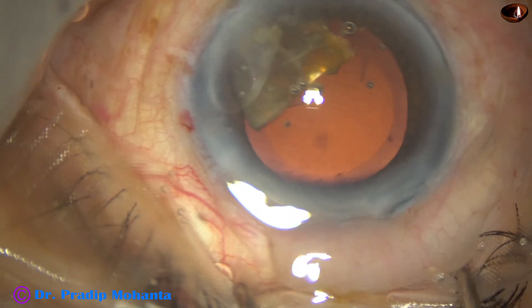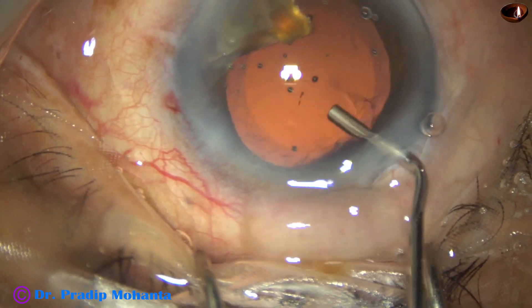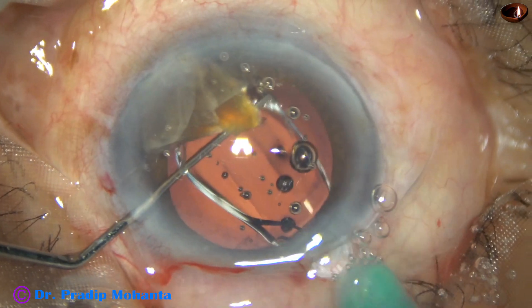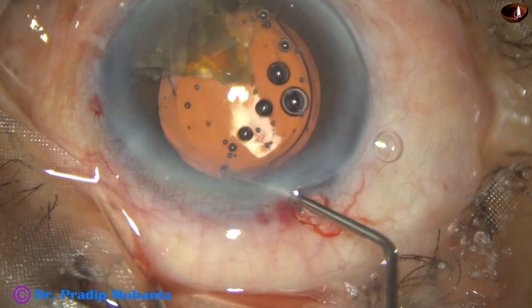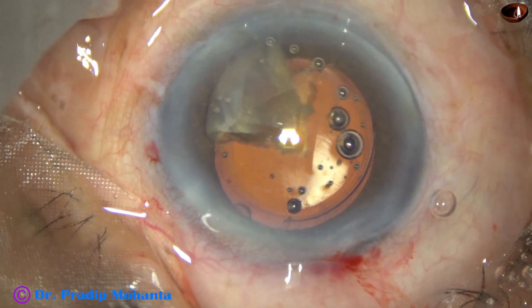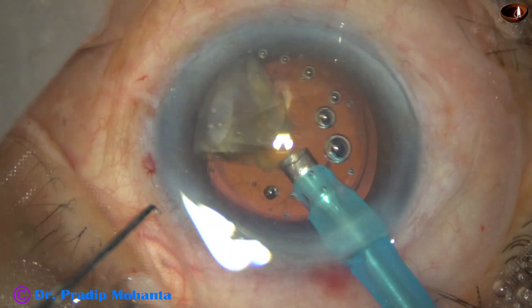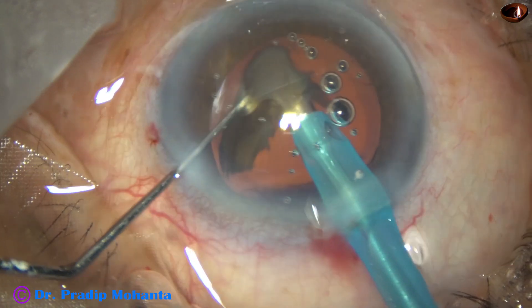Since this is a hypermature Morgagnian cataract, I am not going to emulsify the last piece. I am going to implant the intraocular lens first. This is a single-piece hydrophilic lens — it is placed in the bag. The piece is brought to the center, and now I reduce the exposed part of the phaco needle because I don't want to apply any ultrasonic energy on the surface of the intraocular lens.